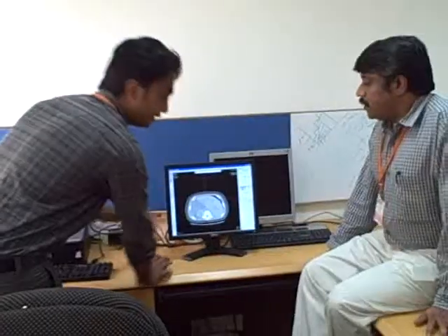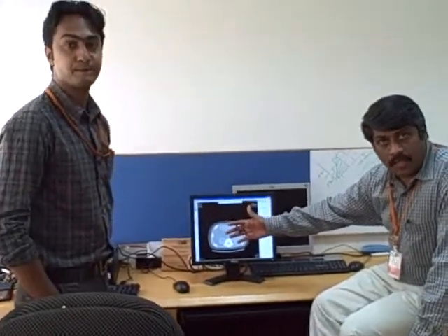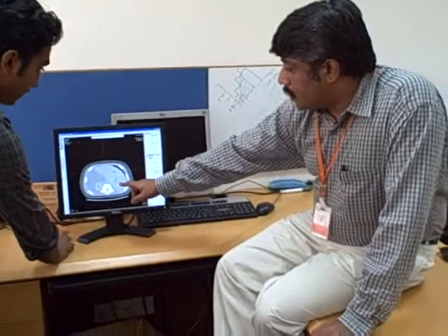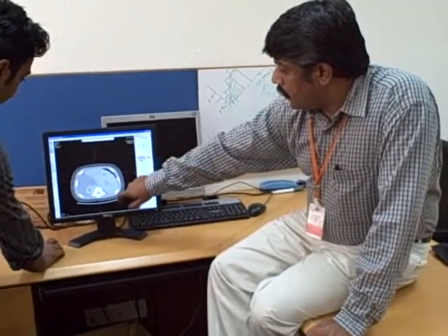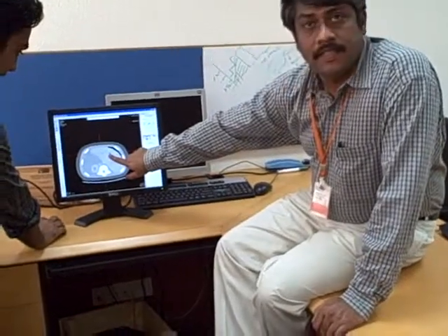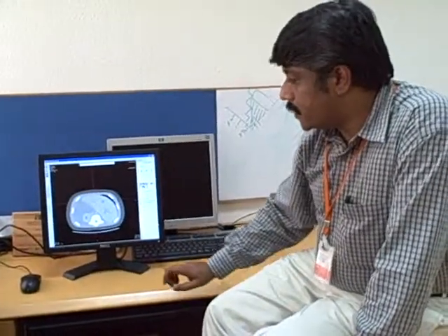So assume this is the cross section of the human body. And the doctor picks a target. For this demonstration, assume this is a tumor. This black surface here is a tumor, and he wants to put a needle to the tumor, take out a small piece of the tissue, and then study whether it is cancerous or not. We're going to be demonstrating how that works here.